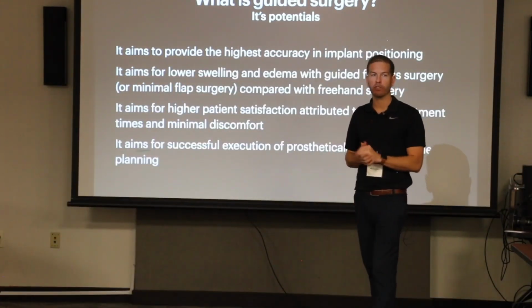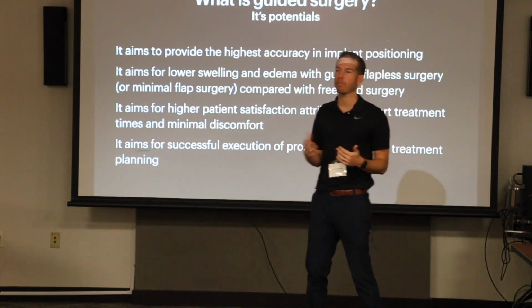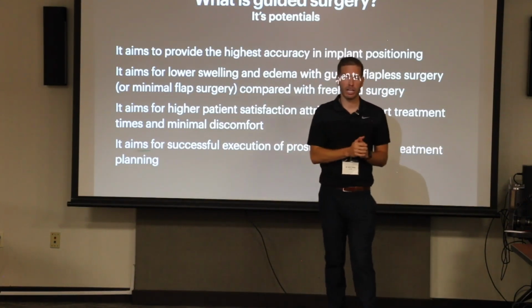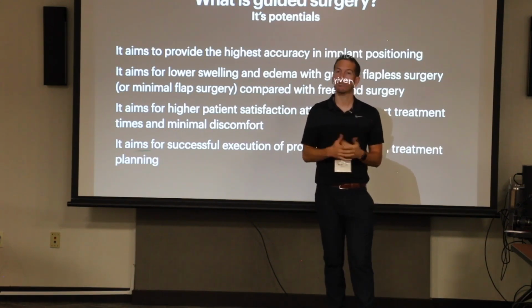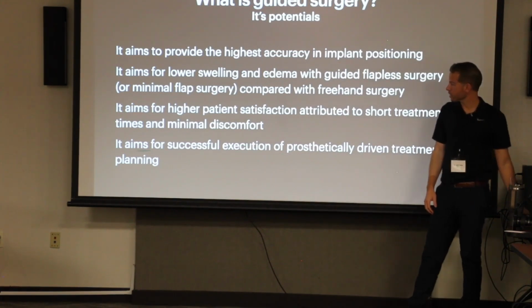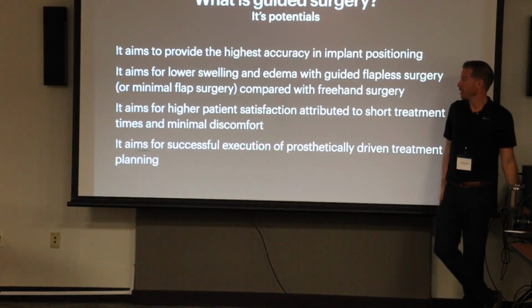The same with the physicians in surgery, they're thinking laparoscopic, and patients know that terminology. So when you can speak to them and utilize, hey, less invasive because of this. Oh, cool, I want that. So that's a potential with guided surgery. So less discomfort, faster healing, less pain if we can control some of those areas.